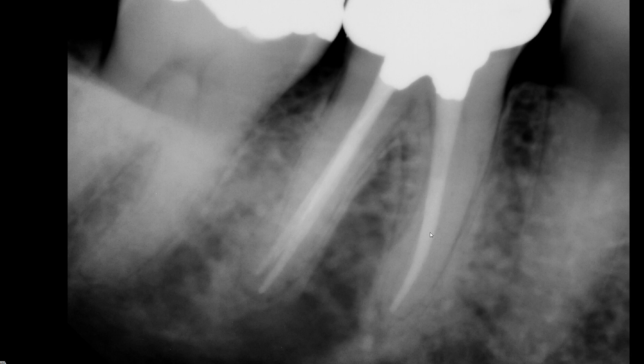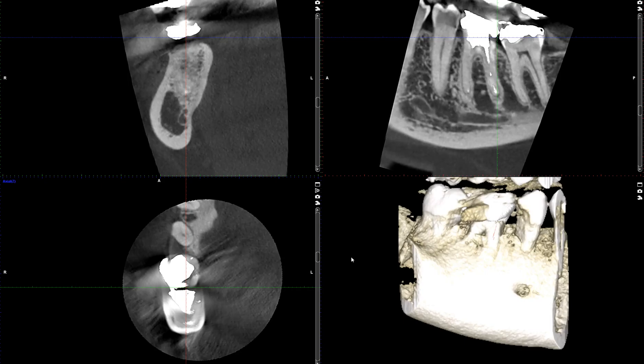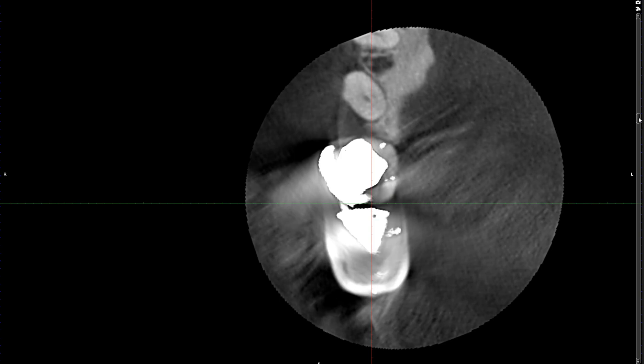Now I'm going to show you a CBCT scan taken on this tooth, which I think will be very interesting. The most telling and representative views in this case are the axial views. I'm going to open up the axial view and scroll from the occlusal plane toward the root apex.